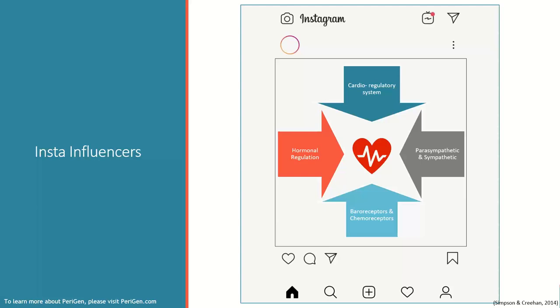And then we have acetylcholine, epinephrine and norepinephrine, and these are released by the adrenals, so hormonal regulation. They control the fight or flight, and they determine the preferential blood distribution. So if the baby decides, okay, I'm just going to slow everything down right now, and I'm going to go into very low variability, so you see your baseline changing, or you'll see variability changing, that's the baby responding with hormonal regulation. We don't have enough time really to go into too much detail, but in our strip review series, when we move forward in the new year, we will be taking certain components and making them a theme of each month's presentation.